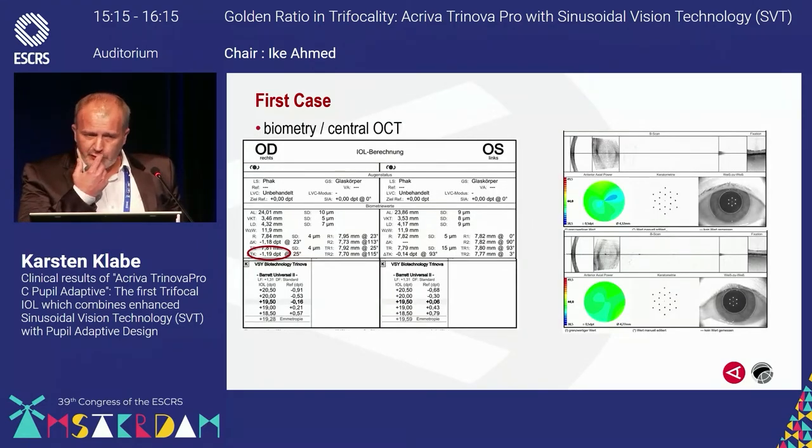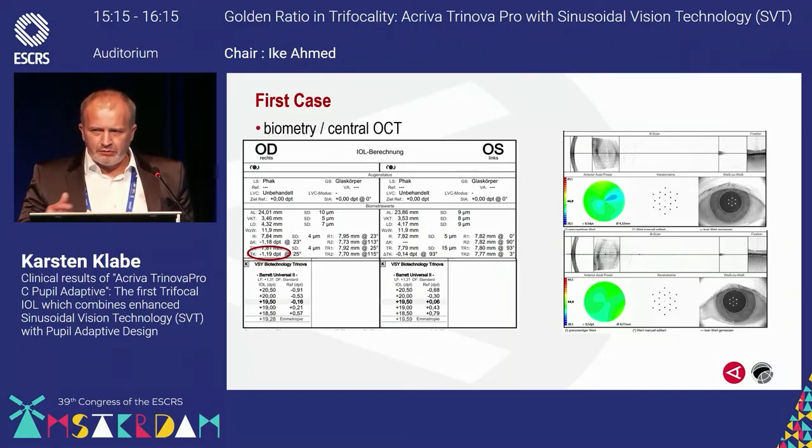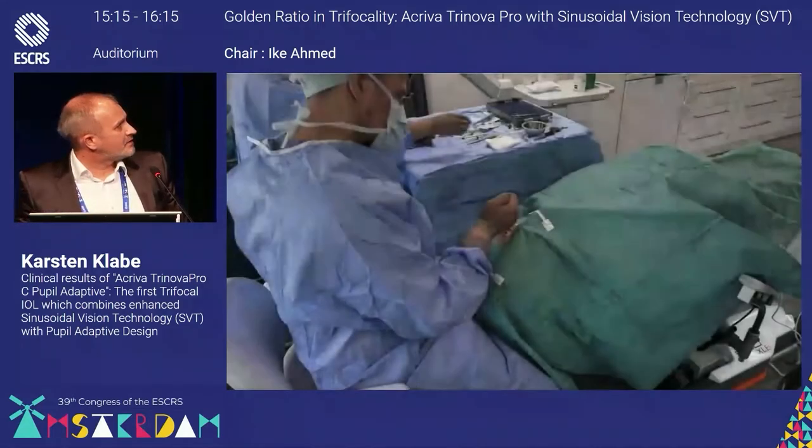So first of all, have a look at the biometry. The Zeiss IOL Master offers a central OCT as well, as you see on the right side. You see the opacification of the lens, and marked in red here, there is an astigmatism. So I would prefer to treat with a toric lens, but at the moment there is no toric model of the Trinova on the market. So we decided to correct the astigmatism with the incision size and location.